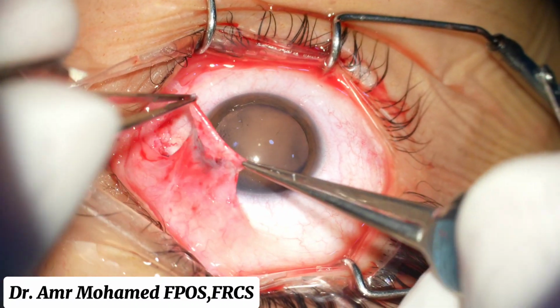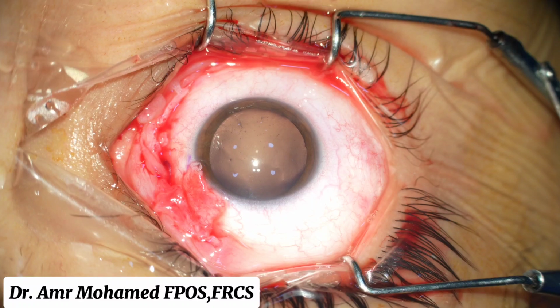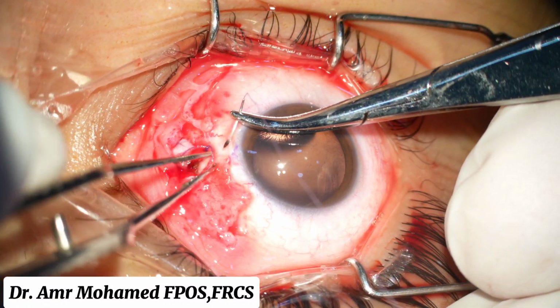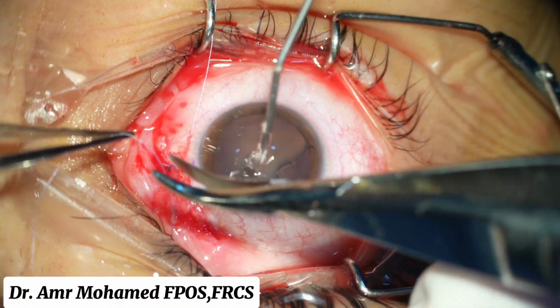After securing the muscle to the sclera, 5.5 mm from the limbus at the original insertion of the medial rectus muscle, I closed the conjunctiva with 8-0 Vicryl, making sure to close the conjunctival buttonholing as well. Thank you so much.